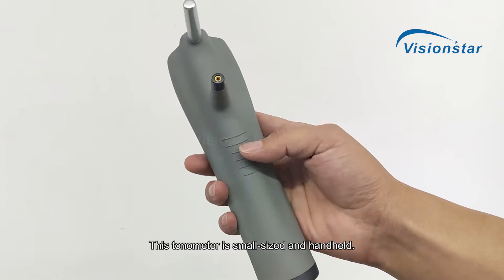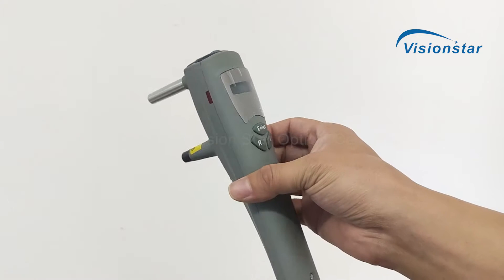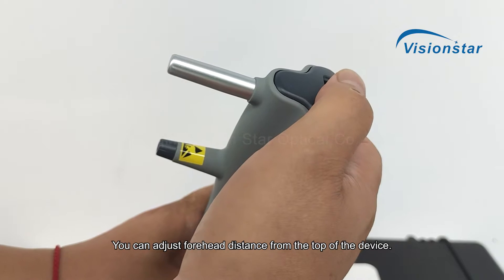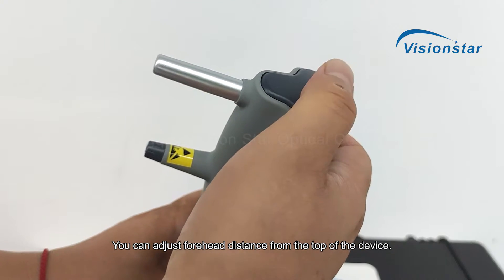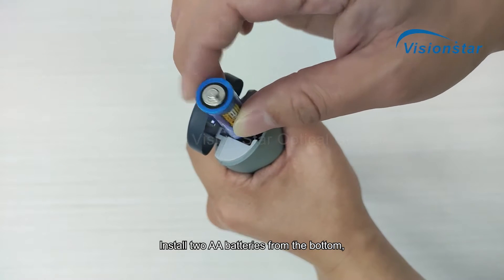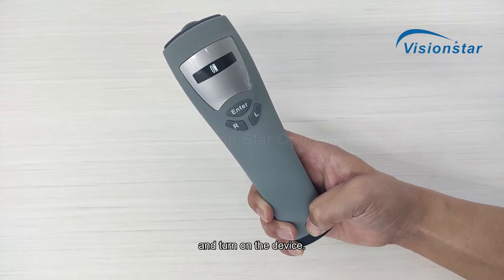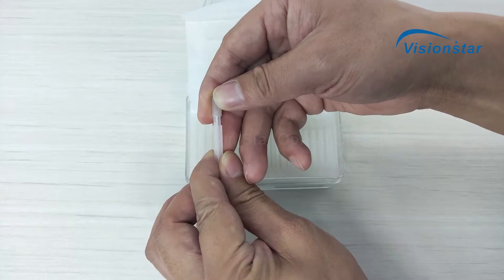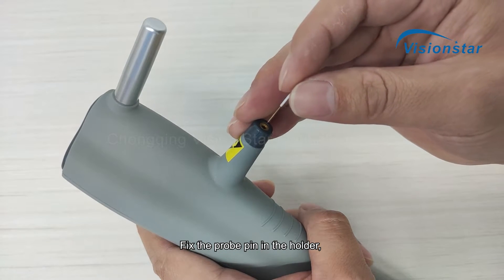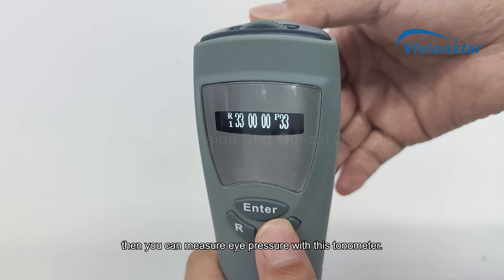This Tonometer is small-sized and handheld. You can adjust the forehead distance from the top of the device. Install two AA batteries from the bottom and turn on the device. Fix the probe pin in the holder, then you can measure eye pressure with its Tonometer.